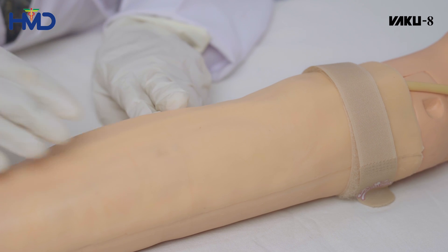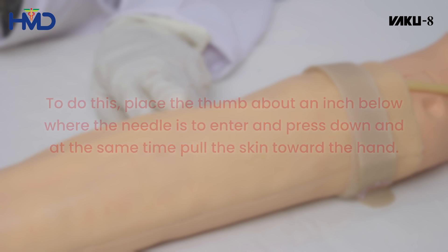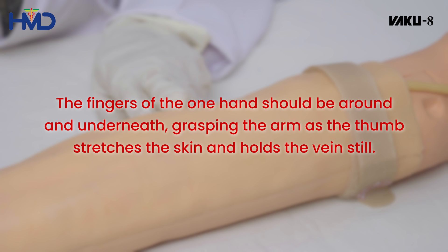To do this, place the thumb about an inch below where the needle is to enter and press down, and at the same time pull the skin toward the hand. The fingers of one hand should be around and underneath, grasping the arm as the thumb stretches the skin and holds the vein still.